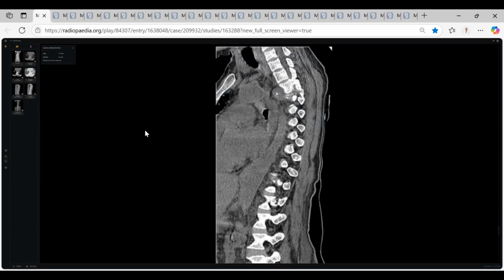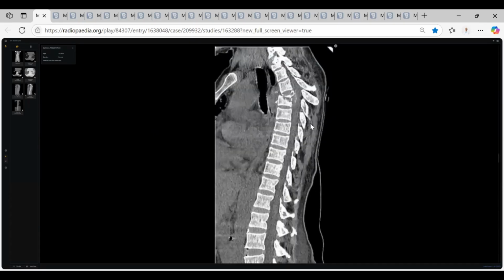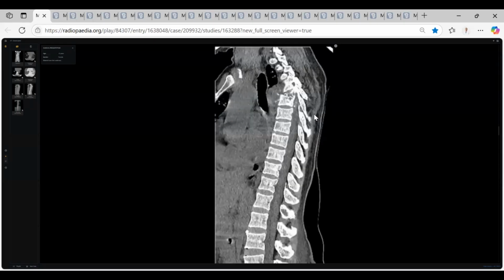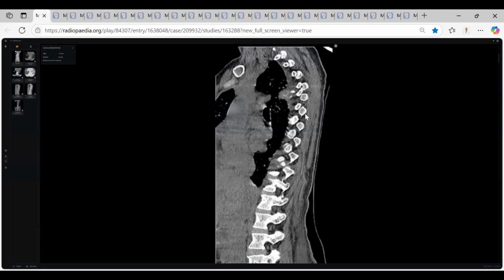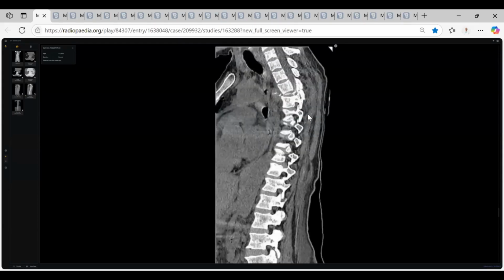Doctor, you can scroll, sir. Yes, scroll, please. It's moving, sir, now. Getting some red blocked area coming, sir. Leave the mouse, leave the mouse.